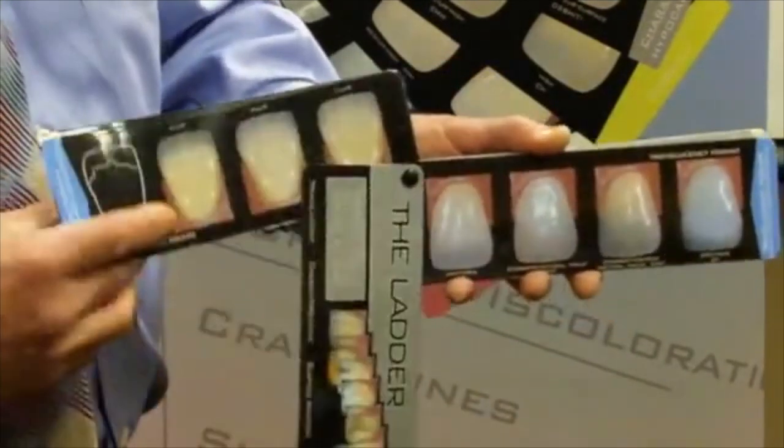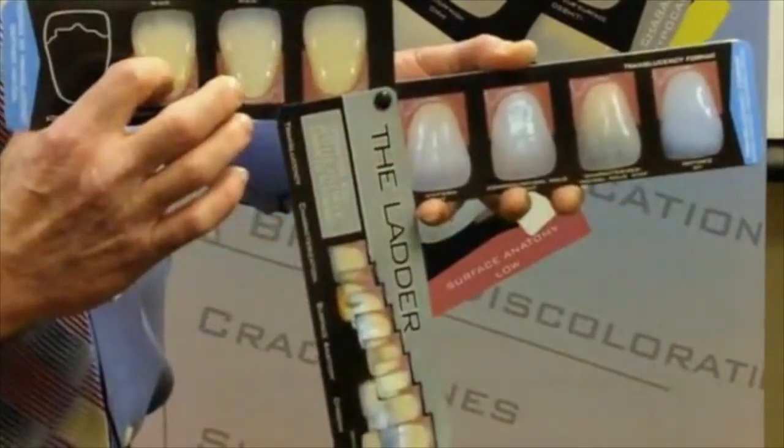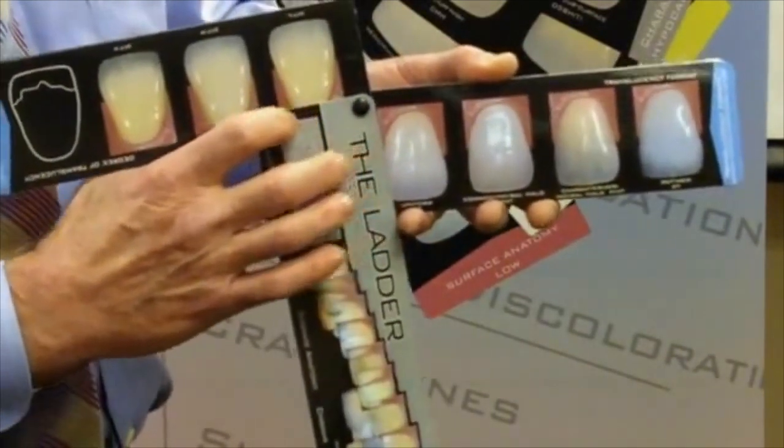Then I want to convey the degree of translucency. Is it low, moderate, or high? This image happens to be low. Again, the majority of patients have a low degree of contrast with the translucency.